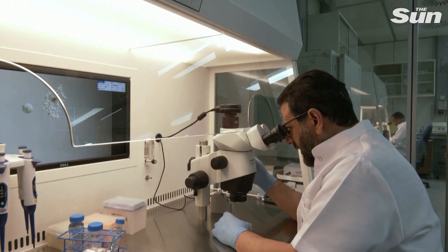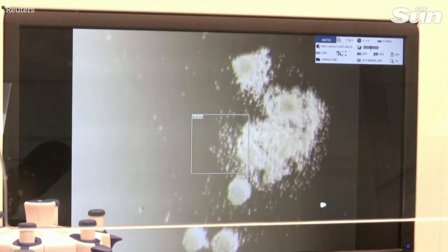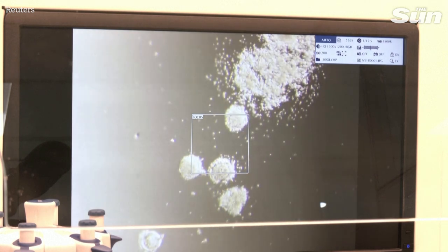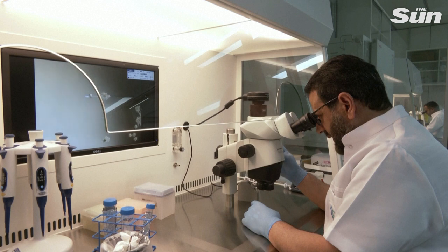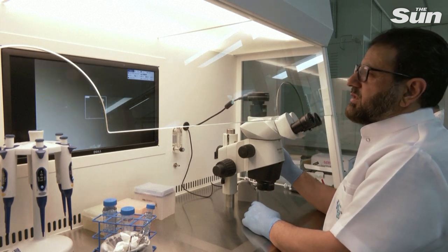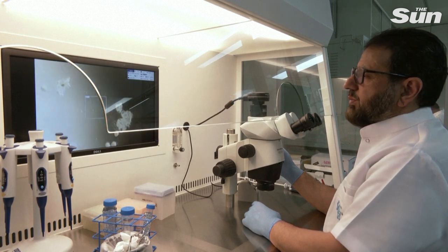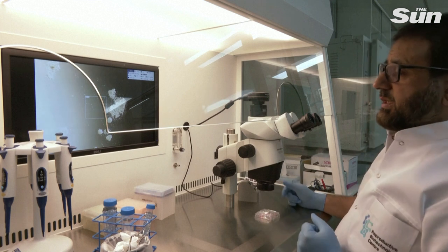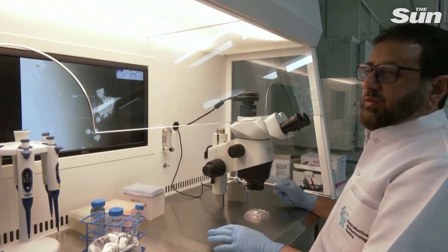Because we get only a couple of ovaries, we have only a few number of the eggs. We mature these eggs for 24 hours. So we collect these eggs from the slaughter camels. We collect the ovaries from the slaughterhouse, and then we collect these eggs from the ovaries of the slaughtered animals, and we have to mature them in the lab for 24 hours.